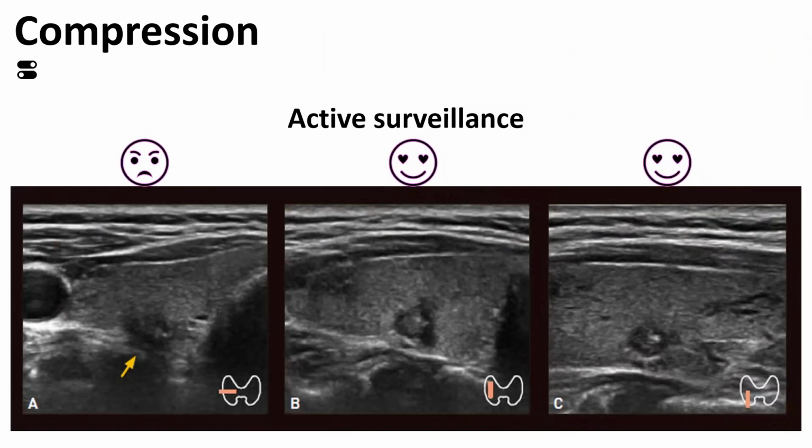Too much pressure is also a problem. In the images, you can see the thyroid micronodule. The ultrasound shows the highly suspicious shape, which is highly at risk of cancer. If you press too much, the nodule will be visible to the back of the thyroid gland. If you adjust the proper pressure, you can see the normal thyroid tissue behind the thyroid nodule.